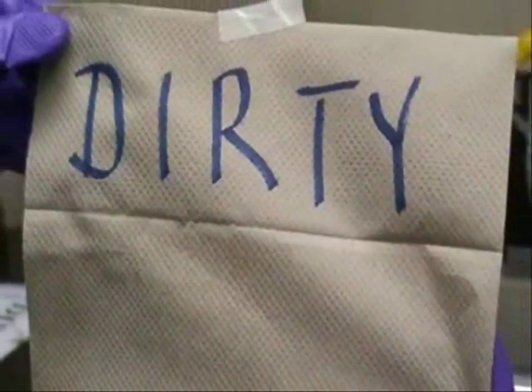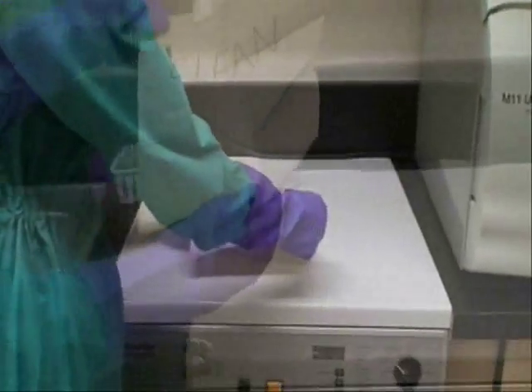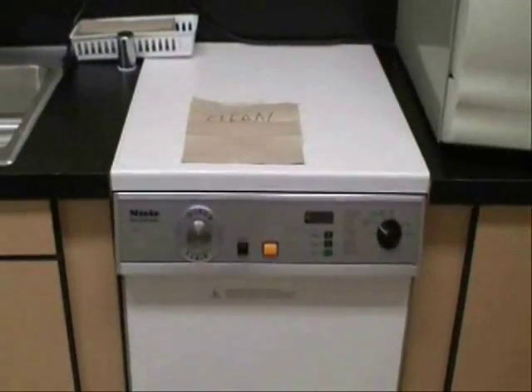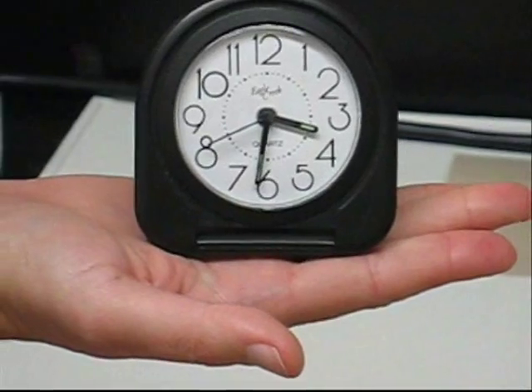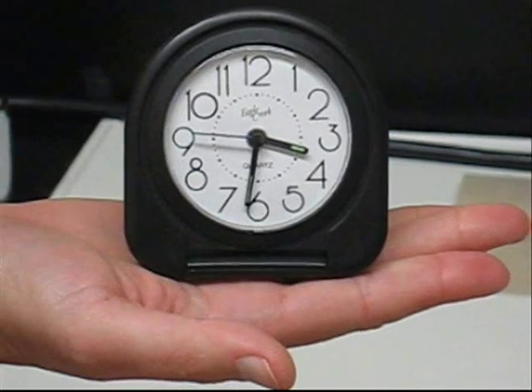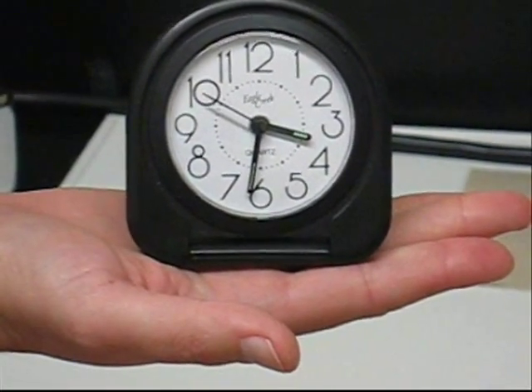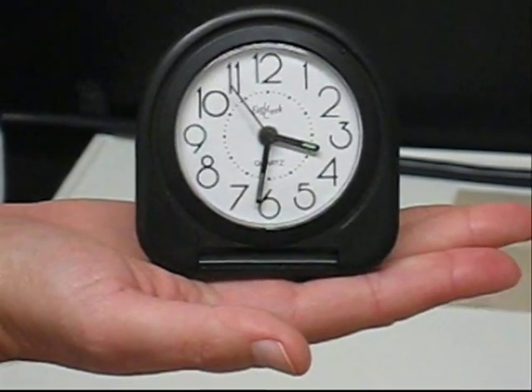At Foothill College, at the end of the sterilization duty, you should place a sign indicating dirty or clean on top of the machine. You should remember not to run the Millay disinfector after 3:30 in the afternoon, since the machine should not be left unsupervised while in operation.